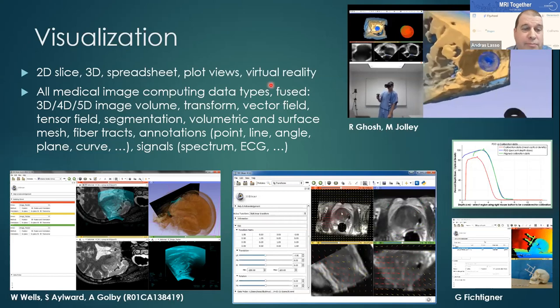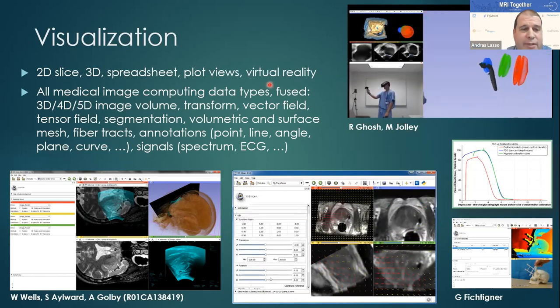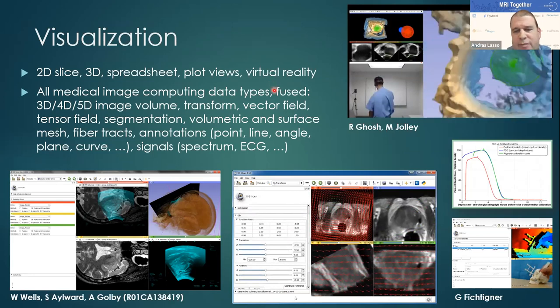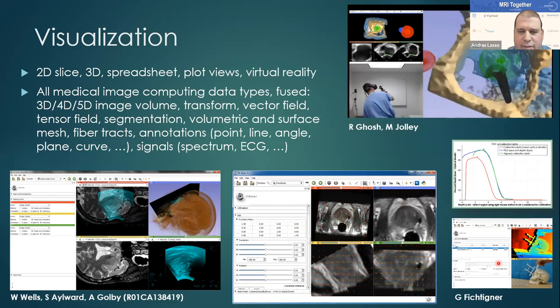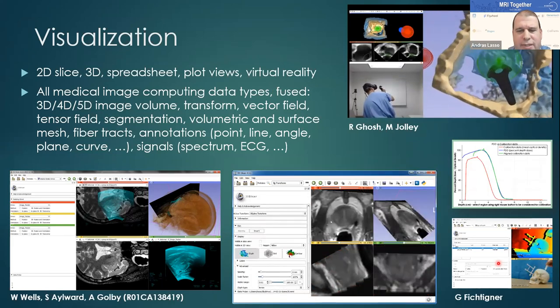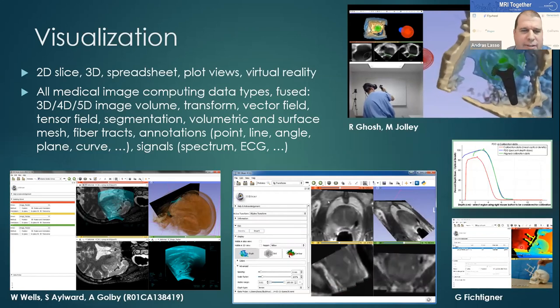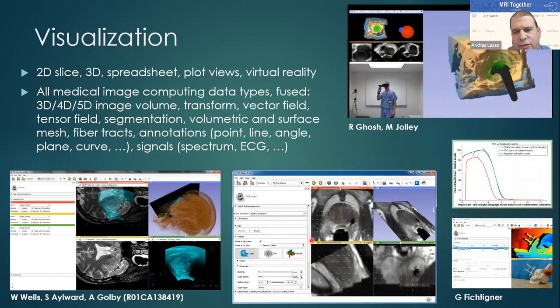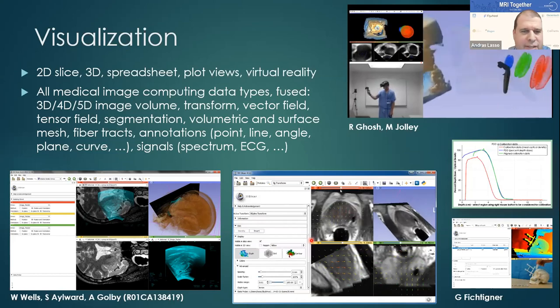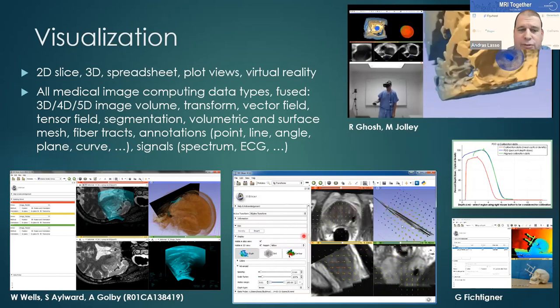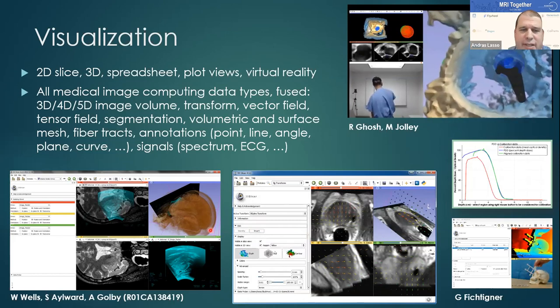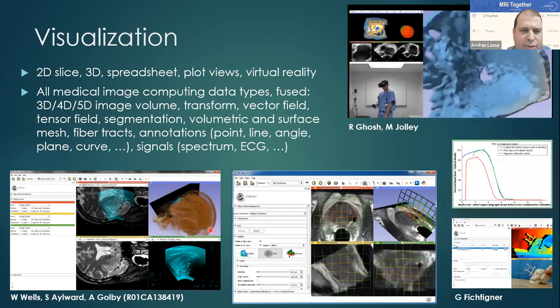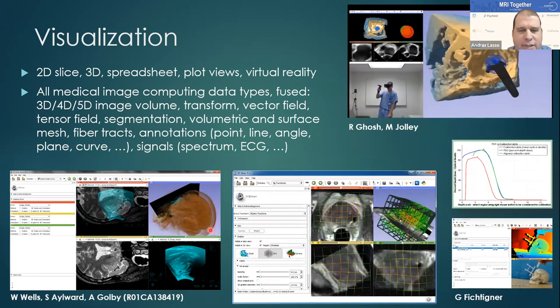Slicer supports all the data types that come up in medical image computing applications — not just 3D images, but also all kinds of 2D image sequences, depth images, and transforms. Slicer supports a wide range of transform visualization and interaction capabilities, and you can display all data sets fused in one view and export everything from a single system.